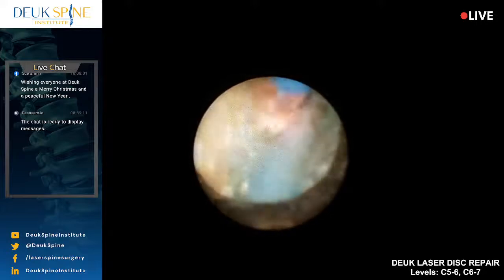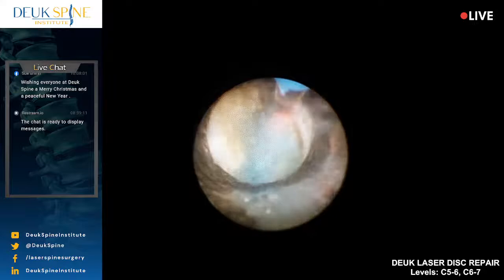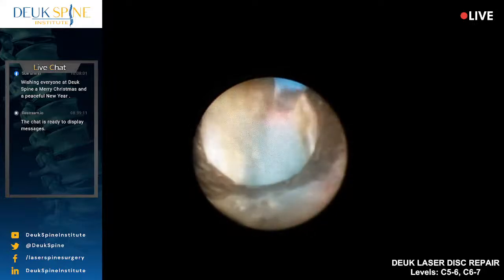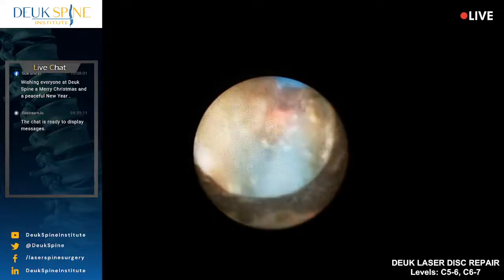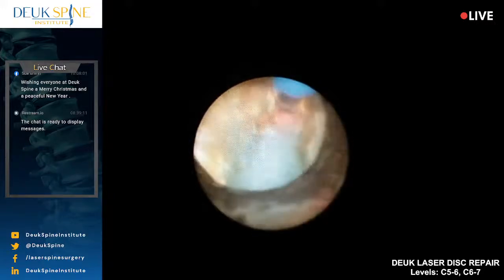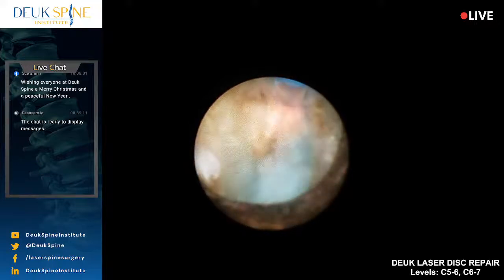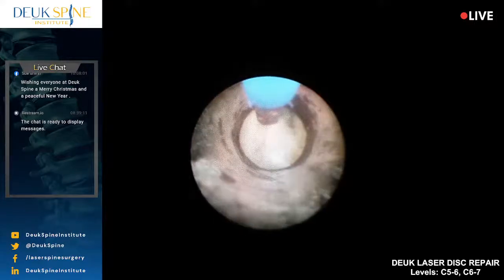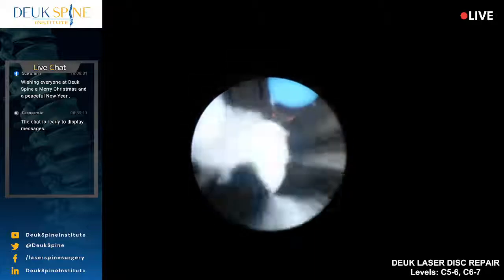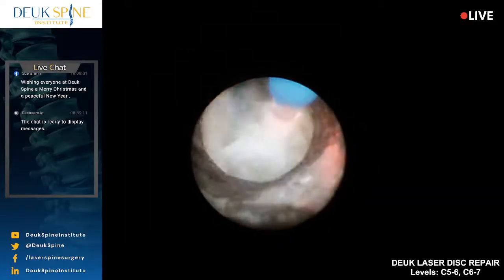I'm looking in his foramen here. For those of you who don't know, I'm looking in the right C6-7 foramen. Okay, and I want to clean up as much of this stuff as I can. This is all scar tissue, and it's scarred up nucleus. The nuclear material is literally stuck to the dura and to the annulus tear right there. And that's causing inflammation and neck pain. That's why people get neck pain when they have a herniated disc.